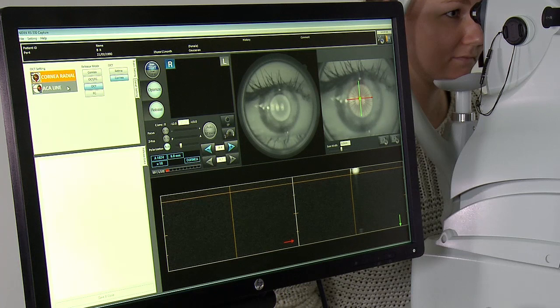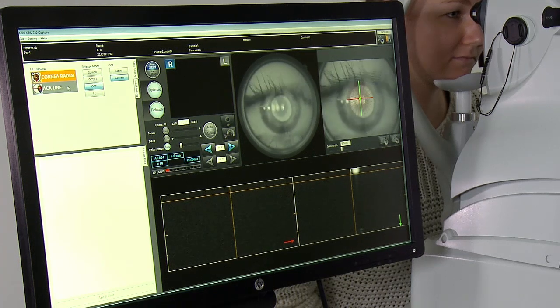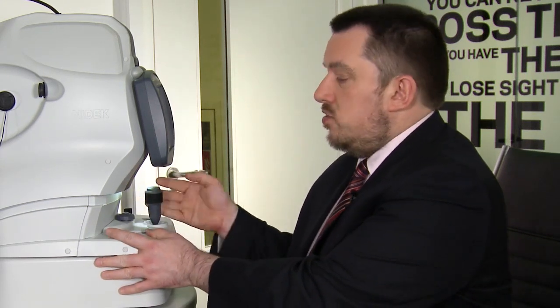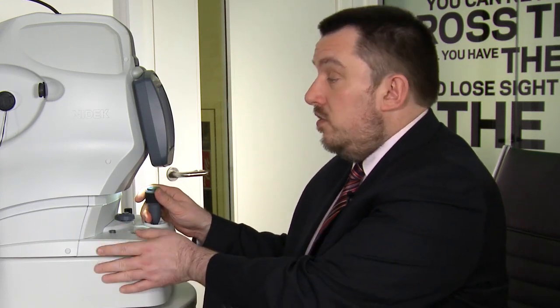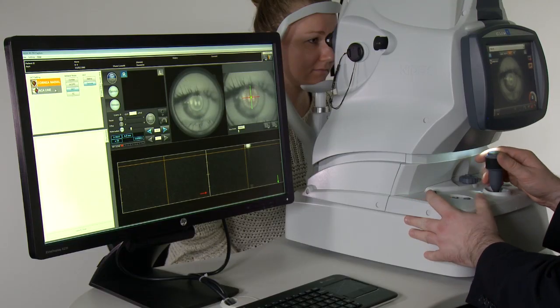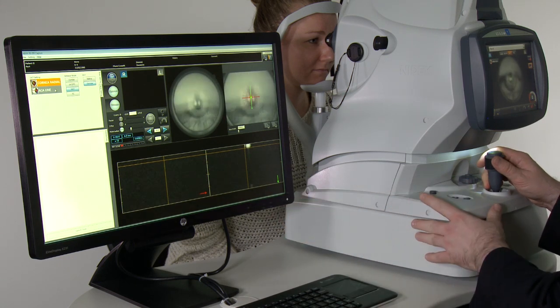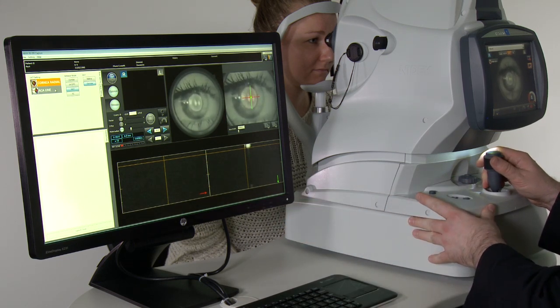Now this anterior OCT is not fully automated, so it's much more important to be quite precise with our movements. So with the patient in place, make sure the device is pulled fully back first, center the device on the patient's eye and slowly move in, always looking at the bottom part of this screen on the computer now.